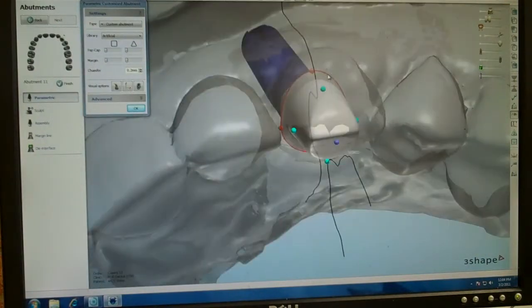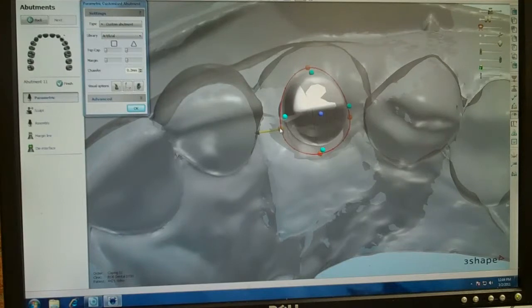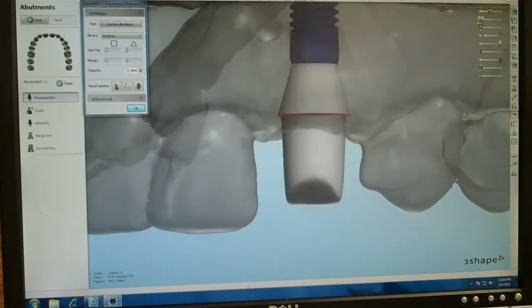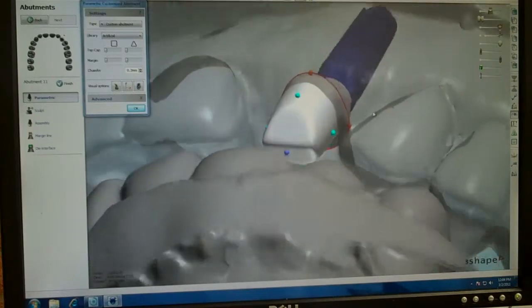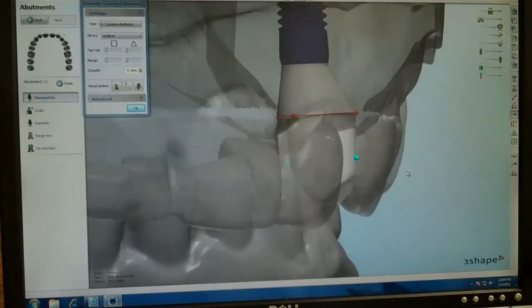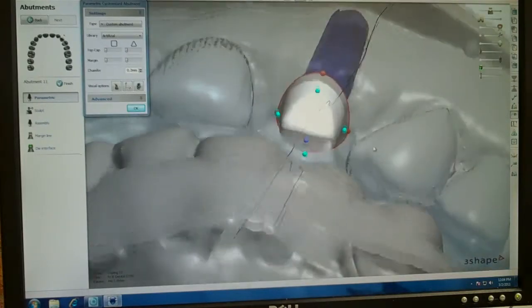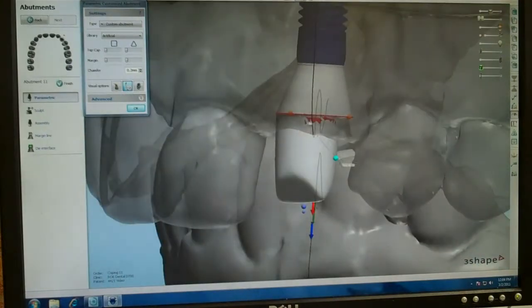We're going to have to blanch some tissue on the buccal to get the facial margin out where it needs to be, and we'll do some slight blanching in the proximals — not much. We also check for clearance on the lingual; we don't have enough right now. This button shows our undercuts — these are minimal.